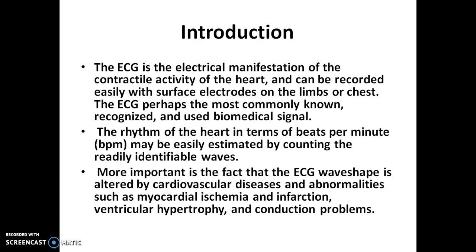It is much recorded from patients because the ECG will give information about whether any heart disease is present in the patient, or if there is any abnormality of the heart, which can be diagnosed using the ECG signal of the patient. Even the heartbeat can be calculated using the ECG signal.